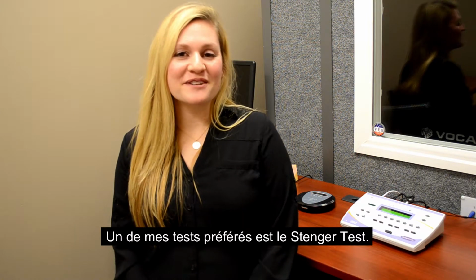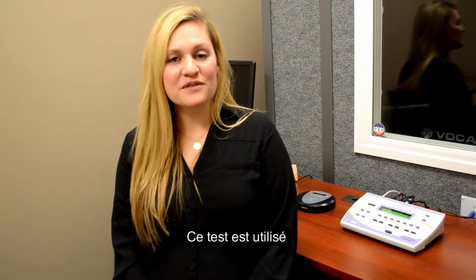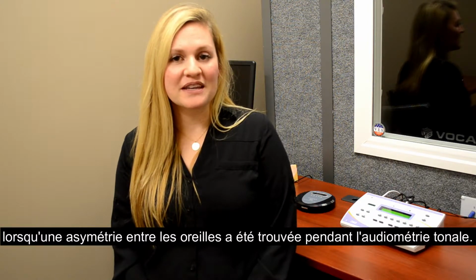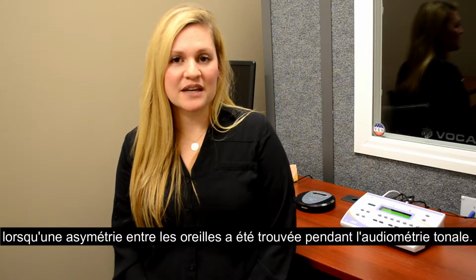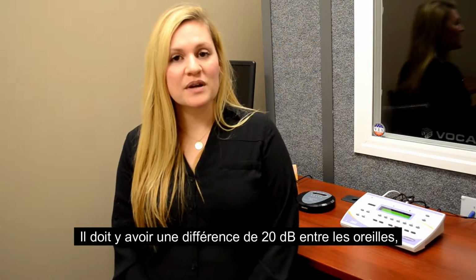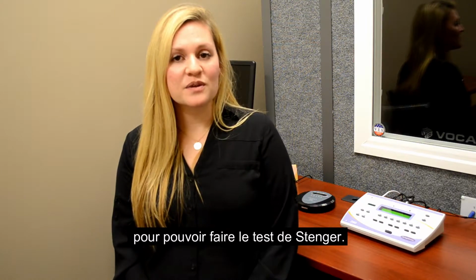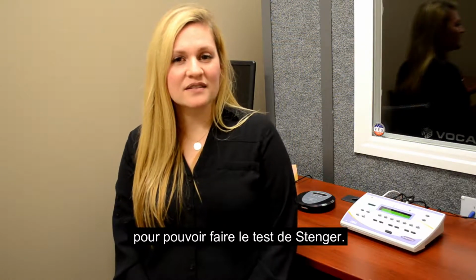One of my favorite special tests to do is the Stenger test. This test is used if you have an asymmetry between ears in your pure tone testing or even in your speech testing. And it has to be a 20 dB gap between the right or left ear, and that's when you would be able to perform the test.